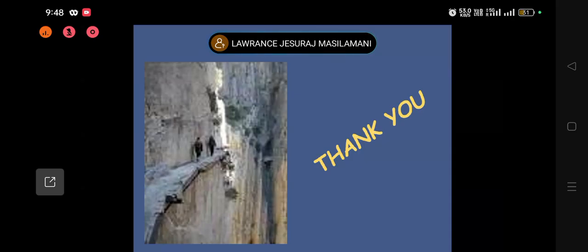Don't be adventurous with AV nodal reentrant arrhythmia, because ablating AV nodal arrhythmia is like walking on a tightrope. You have a very low safety margin. So make sure that you give a safe ablation. Don't cause AV block unnecessarily. With this, I'll close my talk.